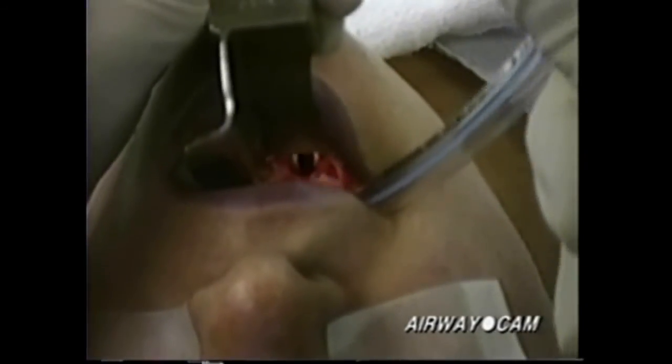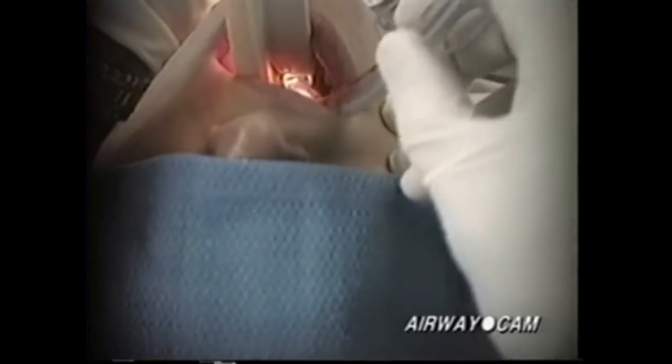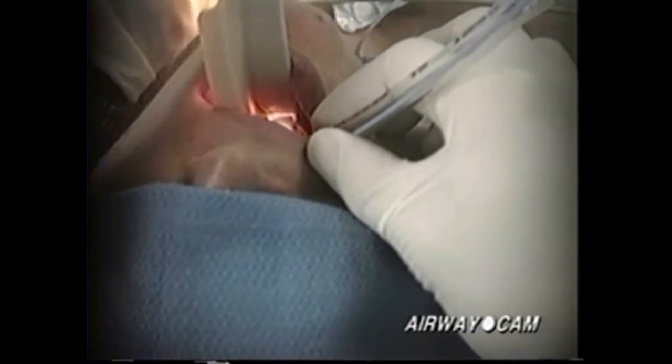Advancing the tube down the midline obscures the line of sight to the larynx and is a frequent cause of esophageal intubation, even after the larynx has been correctly exposed. A tube stylet is generally recommended for emergency situations and facilitates control of the tip of the tube.